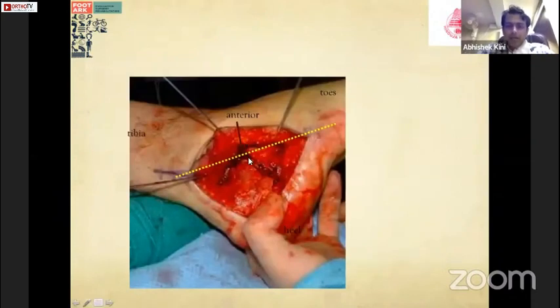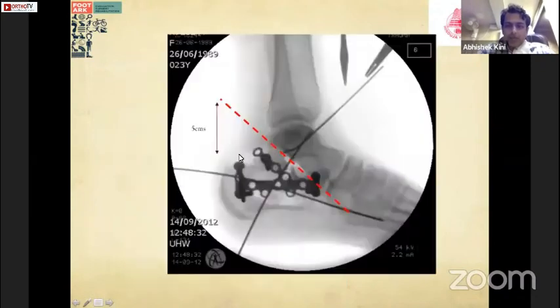You retract it with K wires. I normally hold K wires as seen here. Extension is normally around five centimeters from the calcaneal tuberosity. This is the line I look at so that my entire posterior facet is well exposed without struggling.